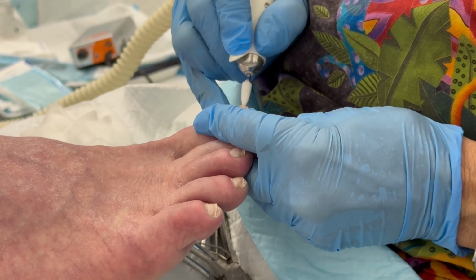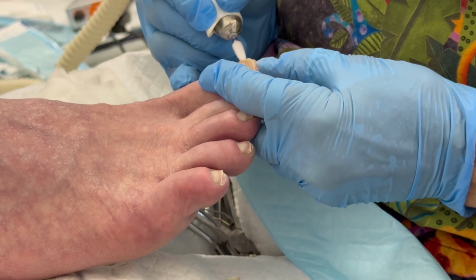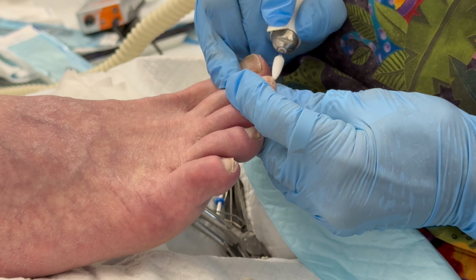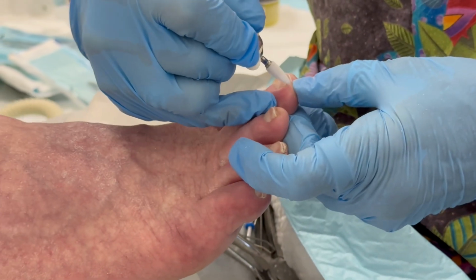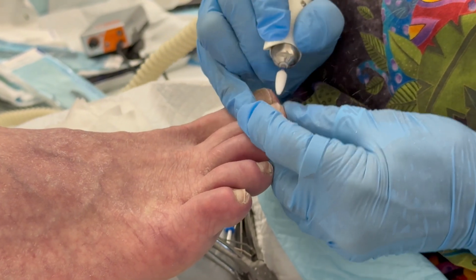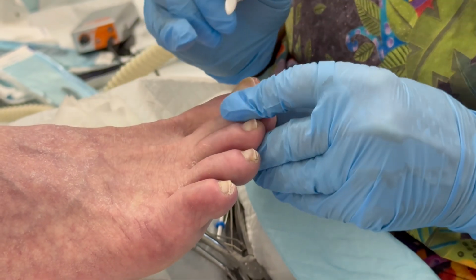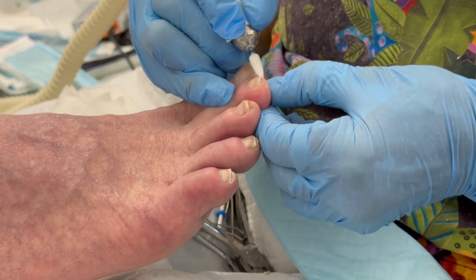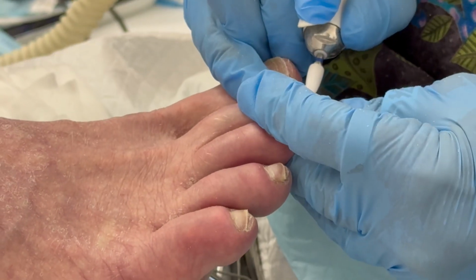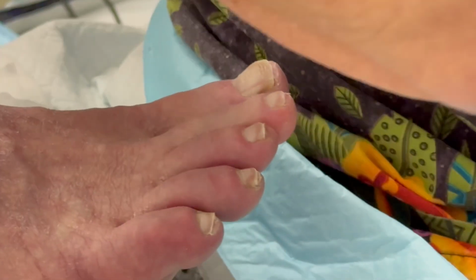Okay, so I'm just kind of cleaning up the edges here. Good, I've covered a lot of topics in one video. Going down there again. Also, this is the first time we've been in this little office. I still haven't fully unpacked. We're in the midst of moving in. It's been slower, we just had a huge atmospheric river, so there's been lots of rainstorms, and I just haven't been over here. Okay, I'm going to use the other burr to clean this up.